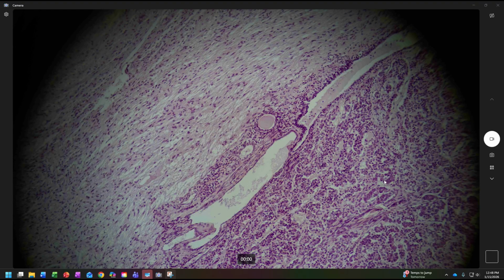These are not just a bunch of random, speckled dots. These are cells. So here they're packed tightly together. The cells are small, cuboid for the most part. Here, they're not cuboid. Again, this is the posterior pituitary. Those are primarily neural tissue or nervous tissue. Remember, go back and review what you learned in Biology 121 or A&P I. Nervous tissue looks kind of wispy and not very dense. And that's what we see here. So this is posterior pituitary. This is anterior pituitary gland.